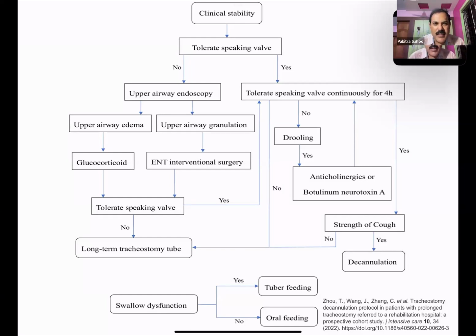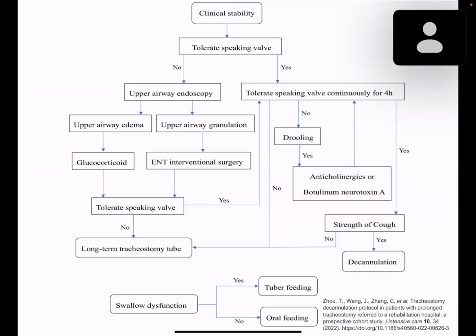Abhishek, do you want to add anything? Is there an advantage of using a metal tracheostomy tube? Actually, sir, I've been using a metal tracheostomy tube because I deal with only poor and chronically ill patients. Those patients are years together on tracheostomy. So usually you put a double lumen tube, which is metal and with an obturator. The basic reason is the same: easy, cheap, and usually we give two tubes to the patient, and they can boil them alternately and keep them clean, because Portex is too costly.